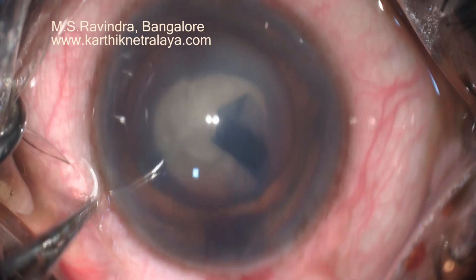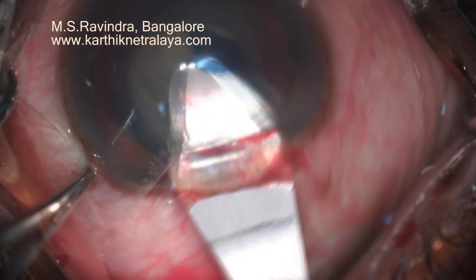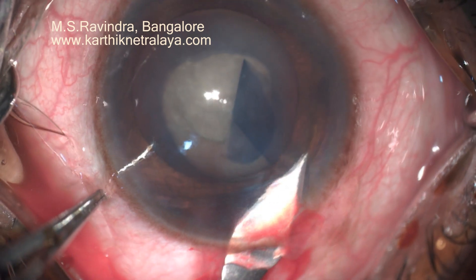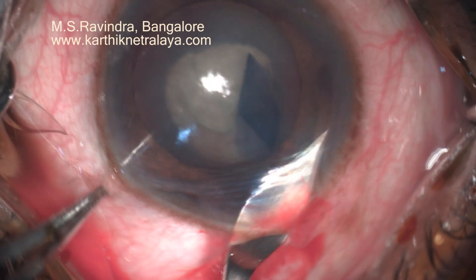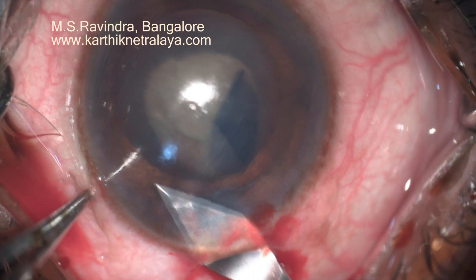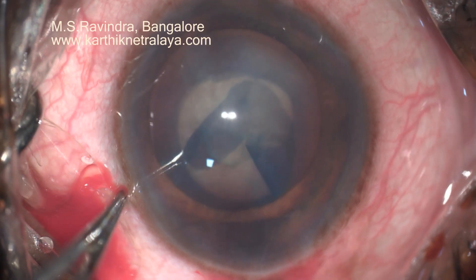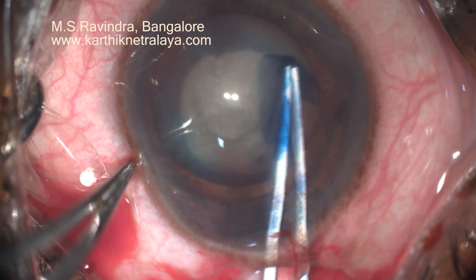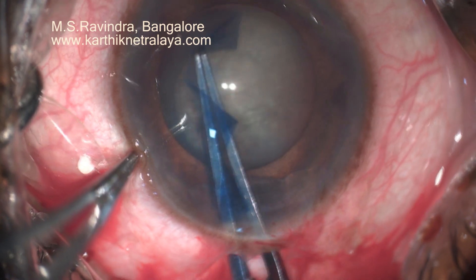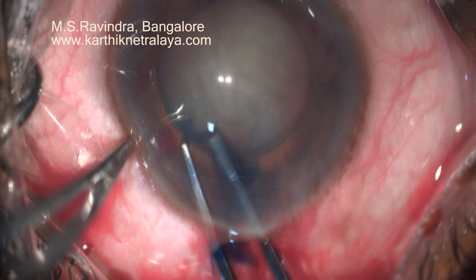Tunnel floor entry keeps the viscoelastic in the anterior chamber and helps me in doing most of the rexis. The tunnel is enlarged. The internal lip is made larger with the 2.8 mm knife. I am continuing the rexis, keeping the lens in the center.